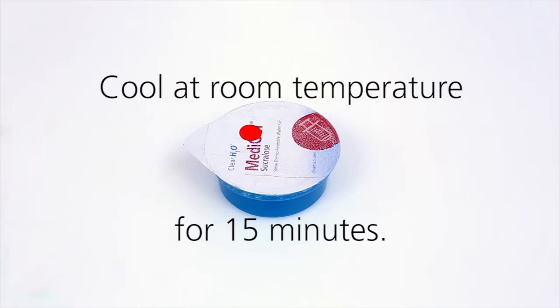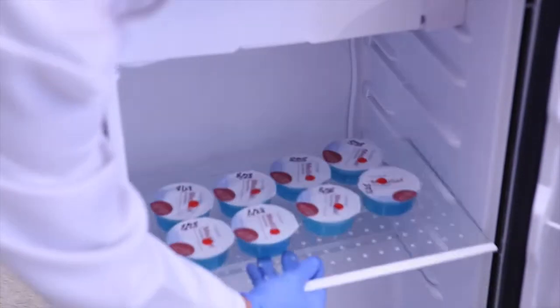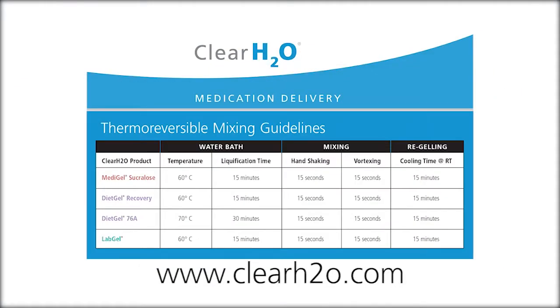Now the cup of liquefied MetaGel Sucralose will re-solidify when allowed to cool at room temperature for approximately 15 minutes. To accelerate the re-solidification process, you can place the cup in the refrigerator and it can remain there until it is needed for application. Please visit ClearH2O's website for the thermoreversible mixing guidelines to determine the correct water bath temperature, liquefaction time, mixing times, and re-gelling cooling times.